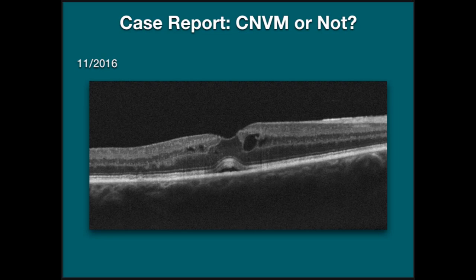Unfortunately, he comes in November, becoming aware again that his vision's not quite right. And we can see that there's been a little bit of a reactivation. The PED has come back up again, and some of that fluid is percolating into the retinal layers. Not as bad as initially, but definitely recurring.